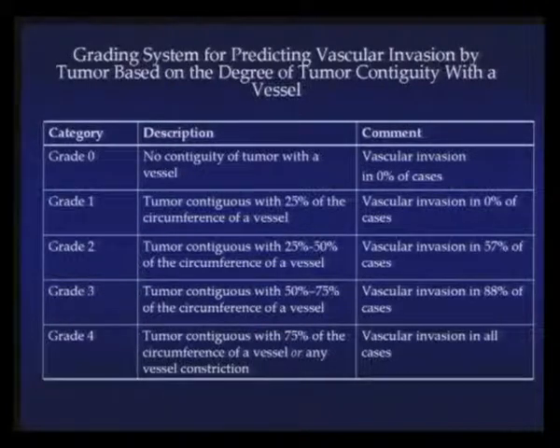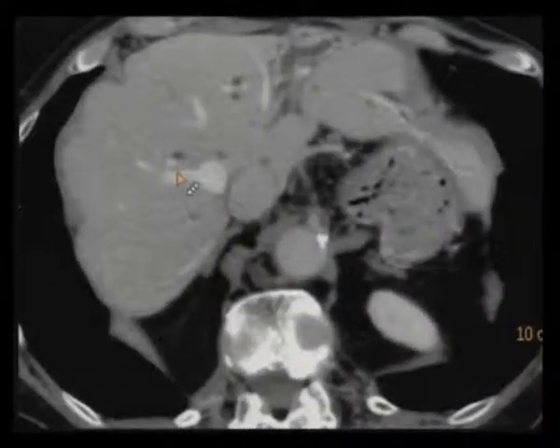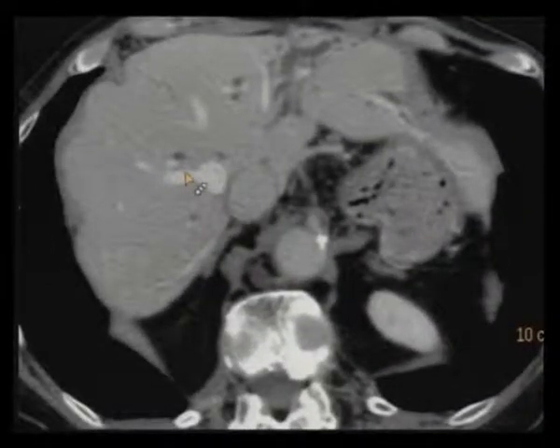And the acquisition of the volume is very quick. It takes not more than a couple of minutes. And then we transfer our volume to our workstation. A lot of the time we know what we are looking for, so the way of working is guided.